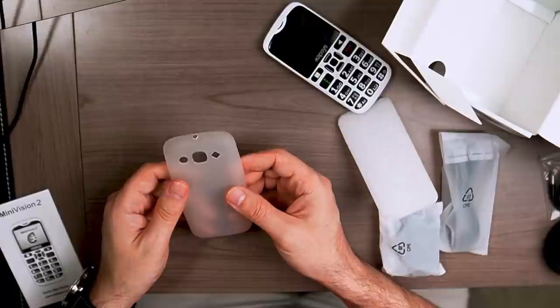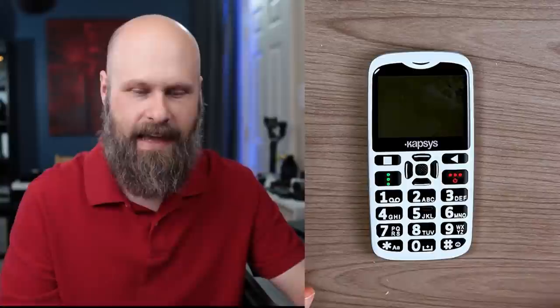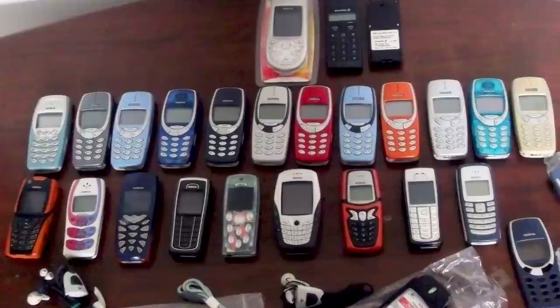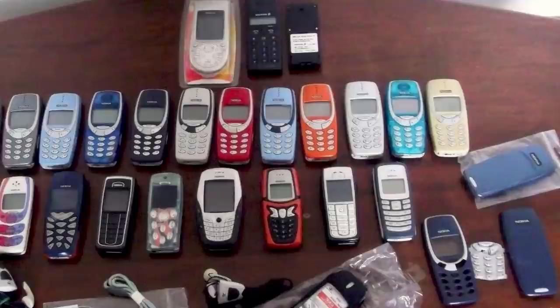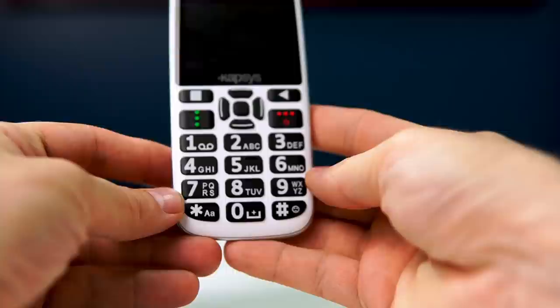The case color is a clear, semi-transparent, frosted material. The style of the phone is what's called a candy bar style — a throwback to the older cell phones of the early 2000s. If you remember what the old Nokias looked like, that's what this is going to remind you of. The phone is white with black buttons, offering a lot of great contrast between the buttons and the background, which is great for low vision users.